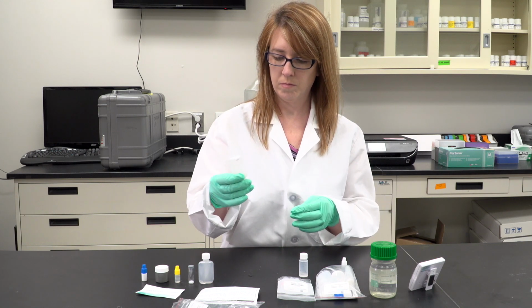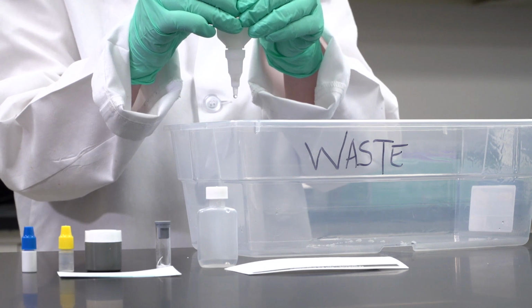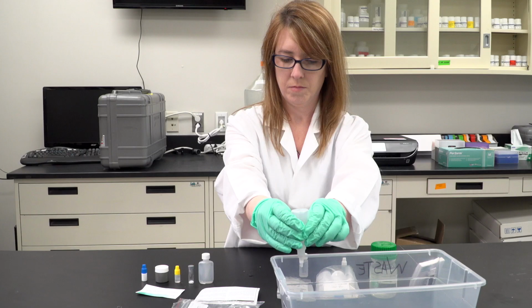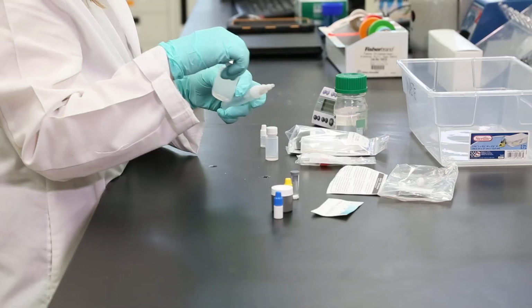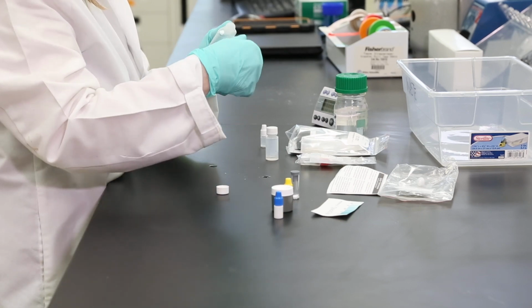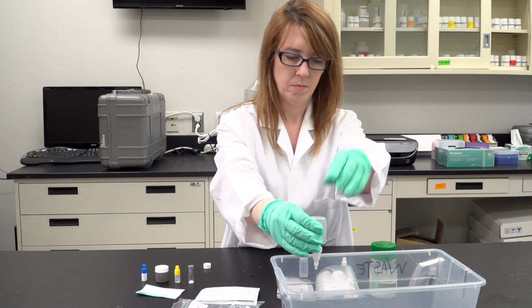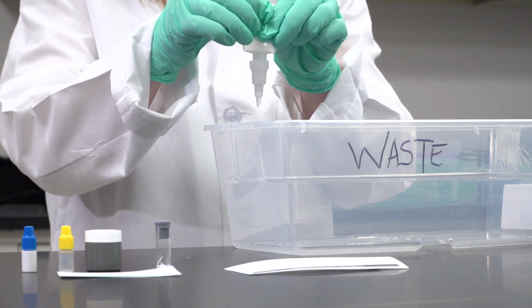Squeeze the bottle gently to expel liquid to waste, being careful not to release hand pressure, as this will cause air to rush into the bottle and may result in a loss of bacteria. If the bottle is squeezed too hard, liquid may escape through the sides of the cap. Remove the filter cap and attach to the wash bottle. Wash sample by squeezing the bottle, expelling the liquid to waste.